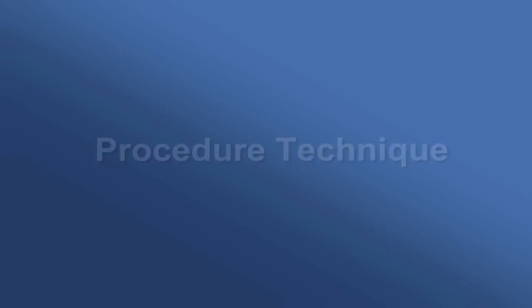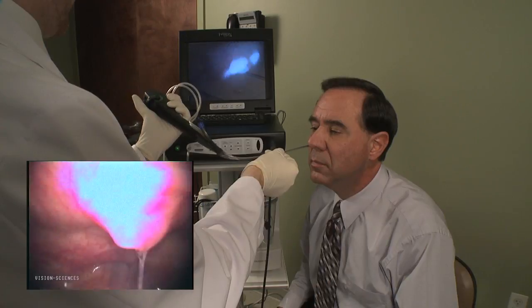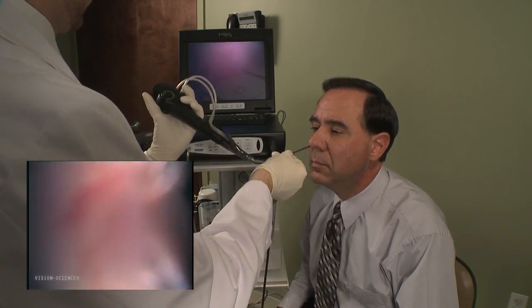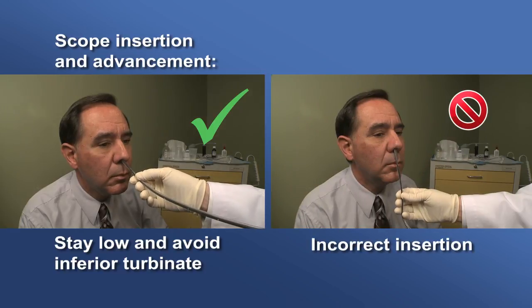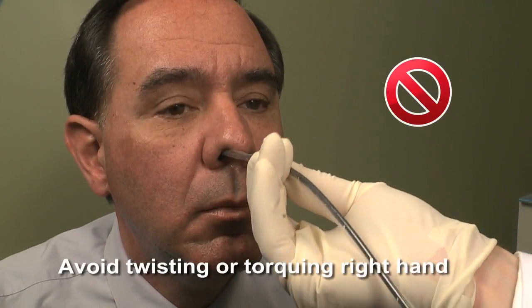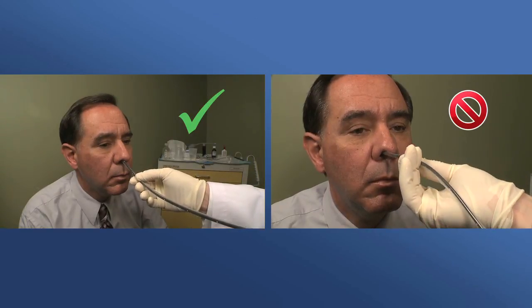Procedure technique and endoscope handling are critical in performing a successful TNE. Proper technique allows the endoscope to stay low along the floor of the nasal cavity. Use the right hand to advance the scope. It is important to maintain a low position while traveling through the nasal cavity to avoid patient discomfort. Avoid torque or twisting of the insertion tube with the right hand, as this could result in disorientation and patient discomfort.